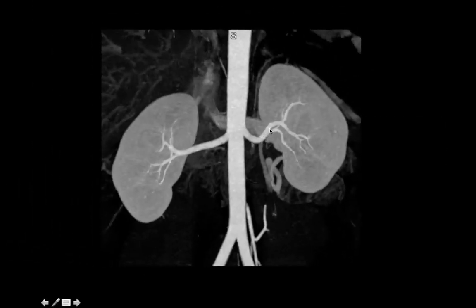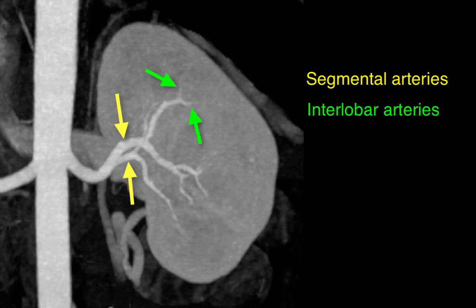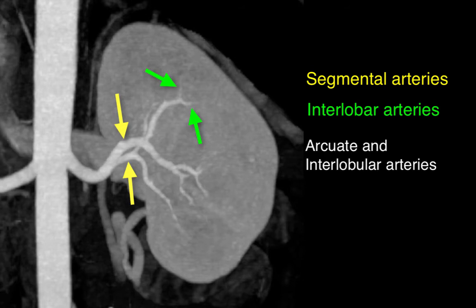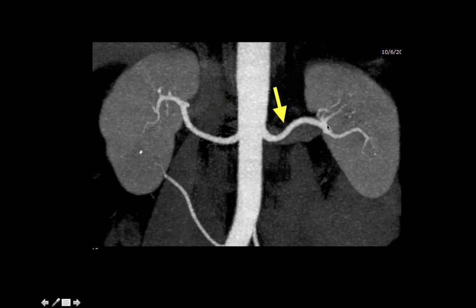Each main renal artery branches into segmental arteries, which course through the kidney and further branch into the interlobar arteries that run along the margin of the pyramid. The interlobar arteries give rise to arcuate and interlobular arteries, which may sometimes be too small to see on CT. In this example, the right kidney is supplied by a main renal artery as well as an accessory artery arising more distally off the aorta, while the left kidney is supplied by a single left renal artery.